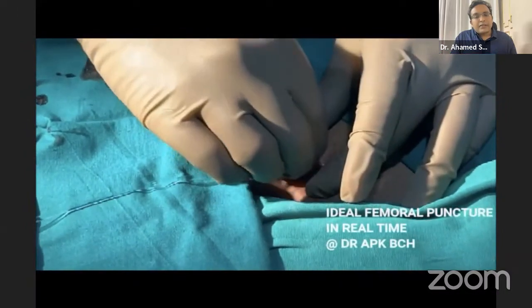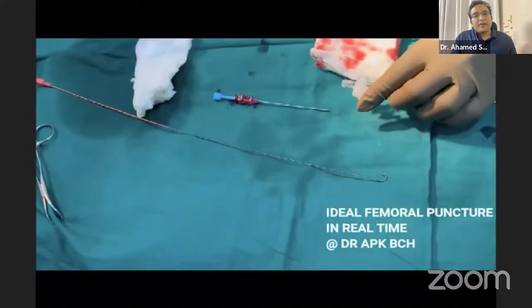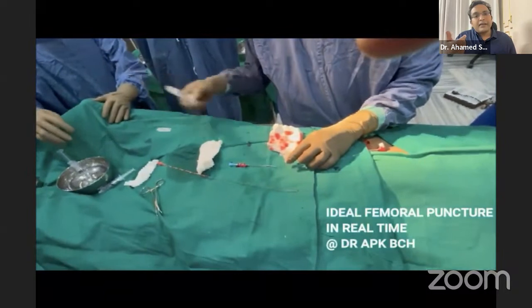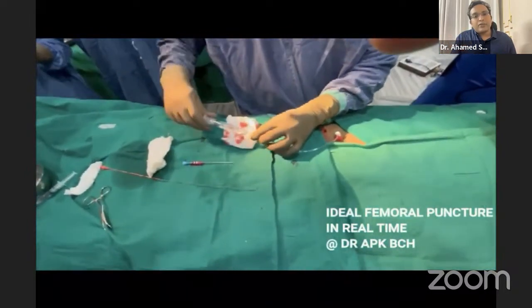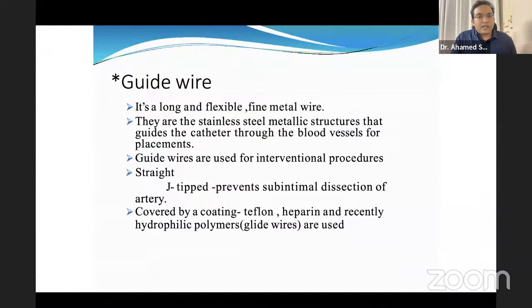After this has been inserted, remove the wire along with the dilator and immediately flush the catheter, keeping the syringe in the vertical position. So, Seldinger needle, usually an 18 gauge needle, and guide wire we have discussed. A guide wire is a long, flexible, fine metal wire. They are stainless steel metallic structures that guide the catheter through the blood vessels, and they can be J-tipped or straight.